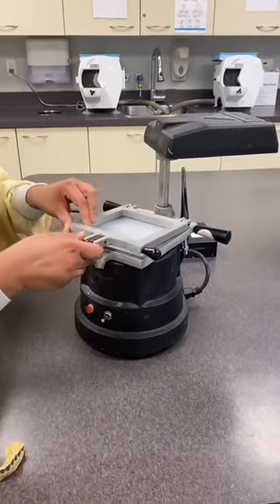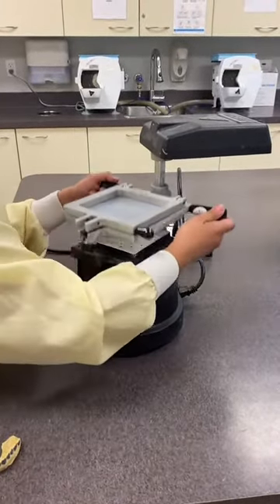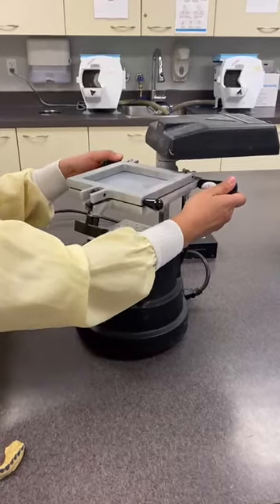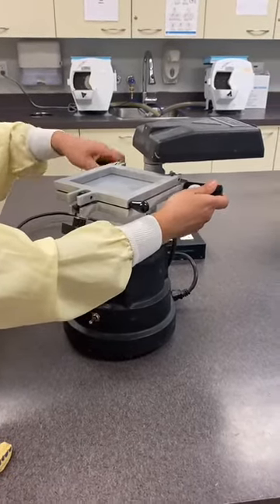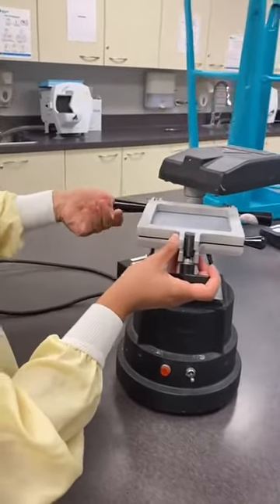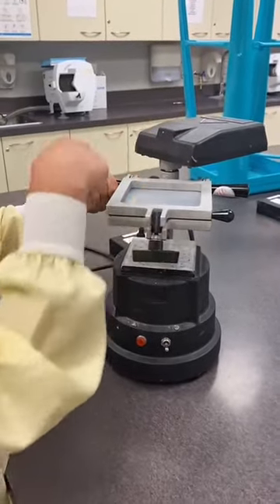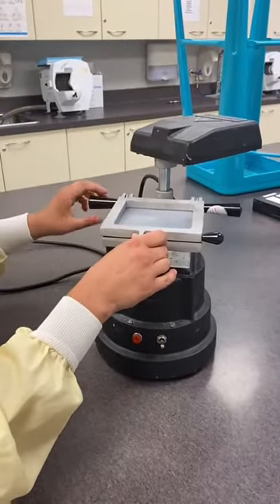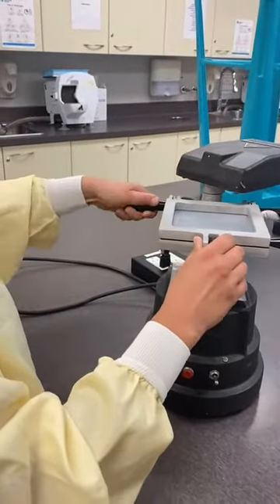Once it's centered well, you get to place the lock on, and then take this part up and use one of the sides to lock it in place. It's just a handle — lock, unlock. When we're going to press it down afterwards, we just unlock it and push it down. So lock it in place there.